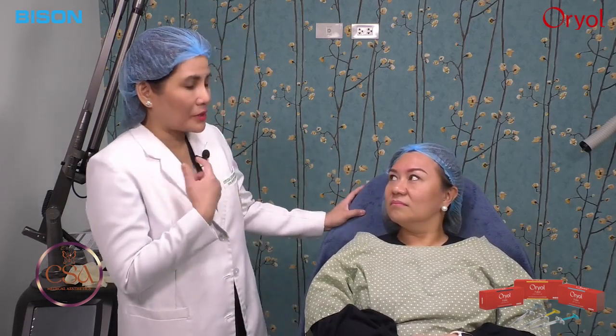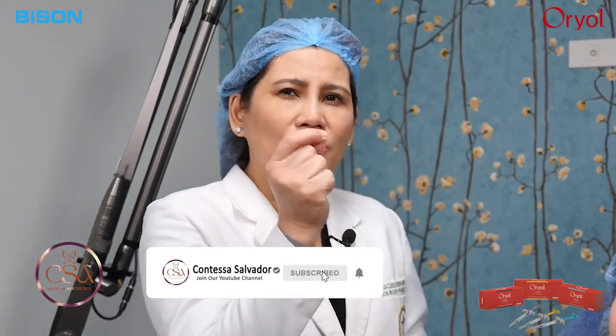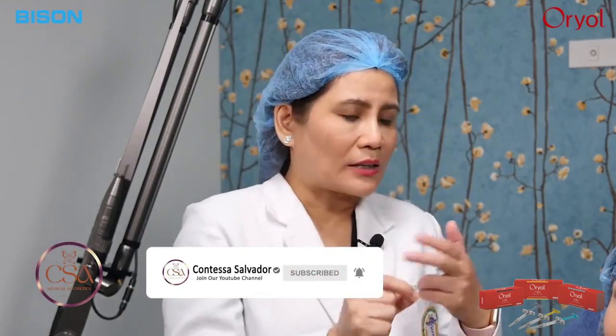We used to have the cream, right? So we also have the pain freeze. Actually, even when I have an injection and I'm not into waiting for numbing cream to take effect, I just spray the area which I will inject. I do my own toxin injections, and the numbing is in seconds only. That's why we have to inject right away. So that also helps to decrease any anxiety about the pain. Okay. Then we use a gauge 30 needle. That is a super tiny needle with less sensation of the injection. So it's a very tiny, minimal prick, but it's tolerable. Very tolerable.